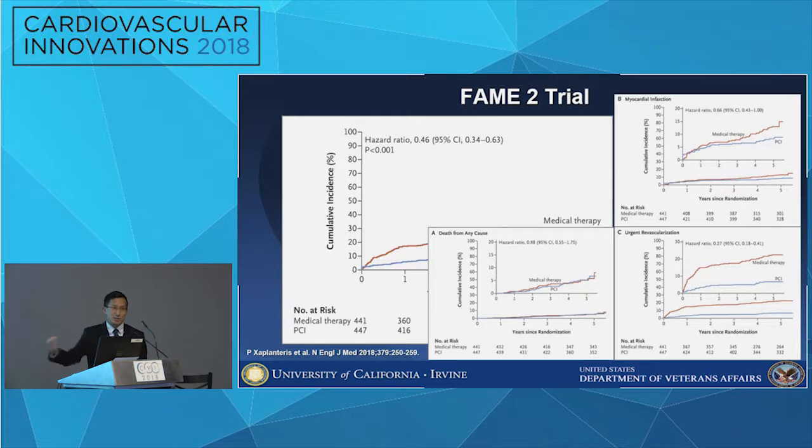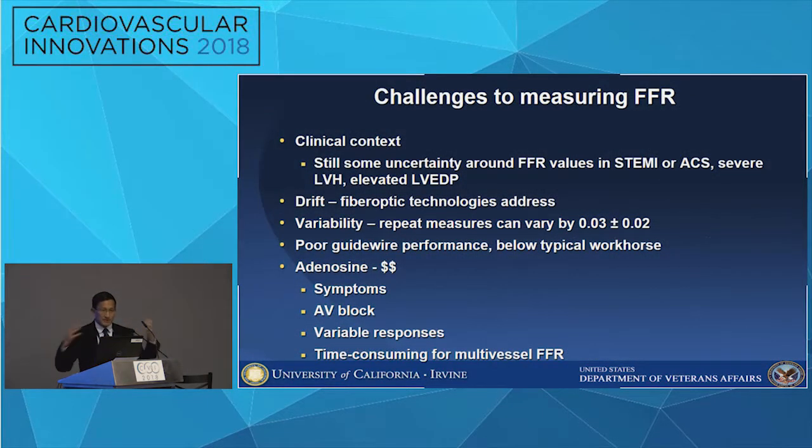So this is the anti-COURAGE. For those of us who are interventional cardiologists, we don't like COURAGE, but we like this study because it says that if you could stent the most severe ischemic lesions, you could potentially prevent a spontaneous MI. So this is a revolution, I think, and a justification, what we've always been looking for in terms of can we prevent MIs by stenting. Now, it's not definitive, but it's at least highly suggestive that we can prevent MIs by stenting the most severe lesions. So why don't we use FFR more often?